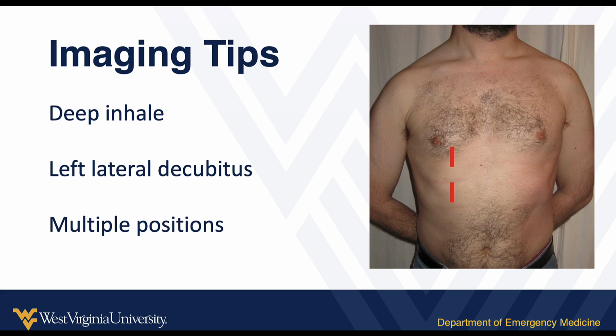Sometimes you may have to go above the costal margin in that same midclavicular line, so that's kind of my second choice. And sometimes you need to image the gallbladder from the mid-axillary line. Sometimes you even go up or down, anterior, somewhere in that axillary line, anterior, mid, or posterior, identifying the kidney and then shooting the beam towards the ceiling or anteriorly on the patient from there.